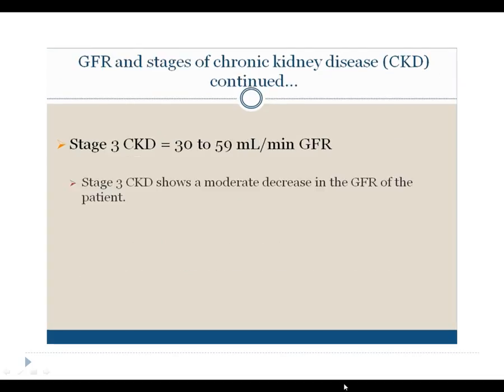In stage 3 chronic kidney disease, anemia and/or early bone disease may appear and is usually treated to help the patient feel their best and reduce problems down the road. MRI contrast can be given to these patients if deemed medically necessary by the radiologist and the referring physician. Patients injected with gadolinium that have stage 3 chronic kidney disease are at a slight risk of developing NSF. The risk must be explained to these patients and they must be consented by the radiologist on duty.